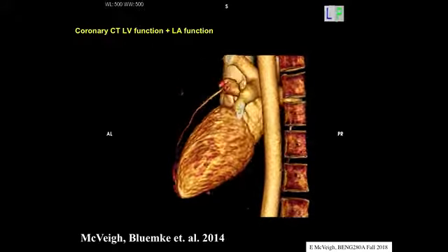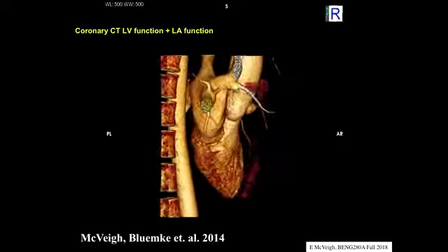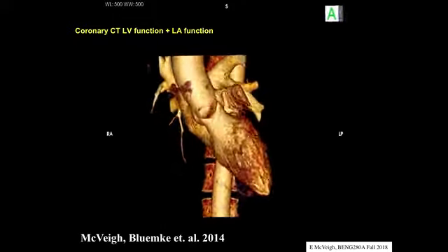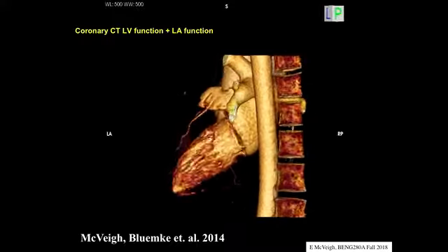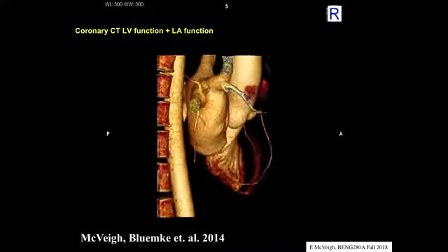The other thing you can do is look at data temporally. Right? So we're going to take images, say, every 150 milliseconds. We'll take a picture. It's a three-dimensional volume. That picture is a 3D volume, and we'll just take one every 150 milliseconds, right?